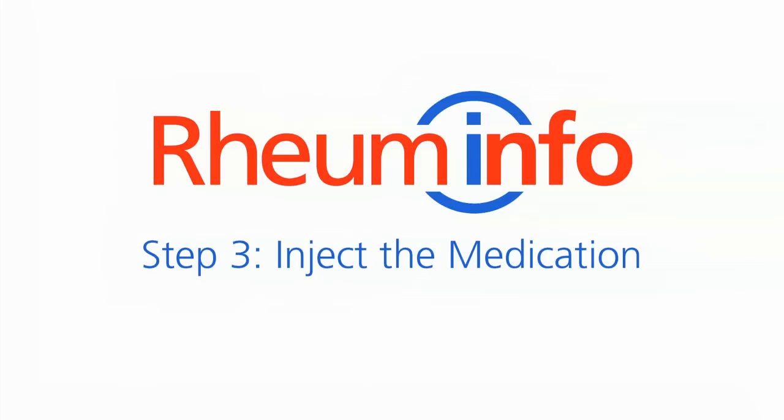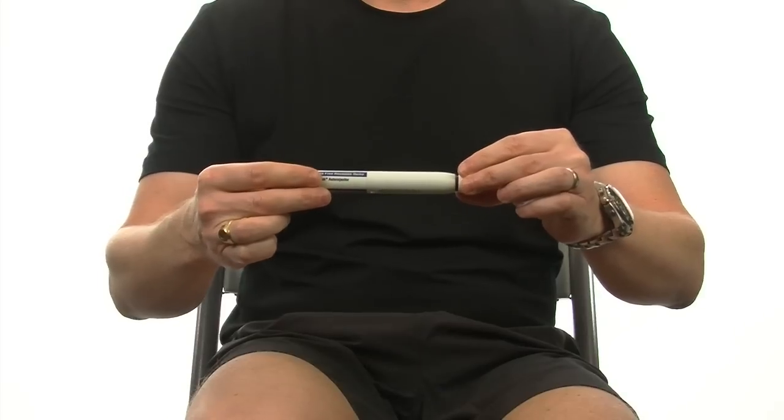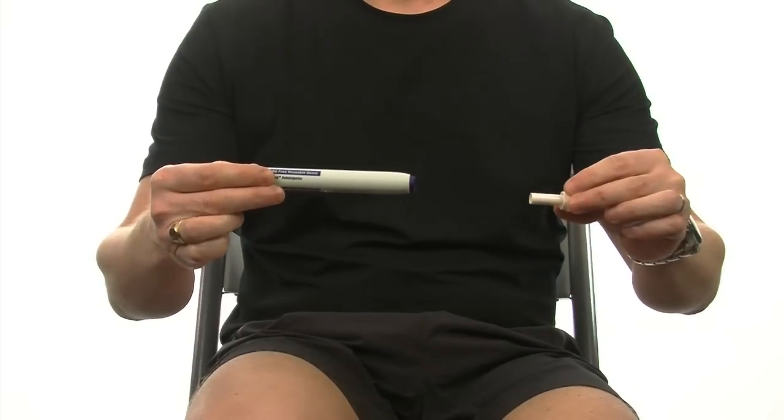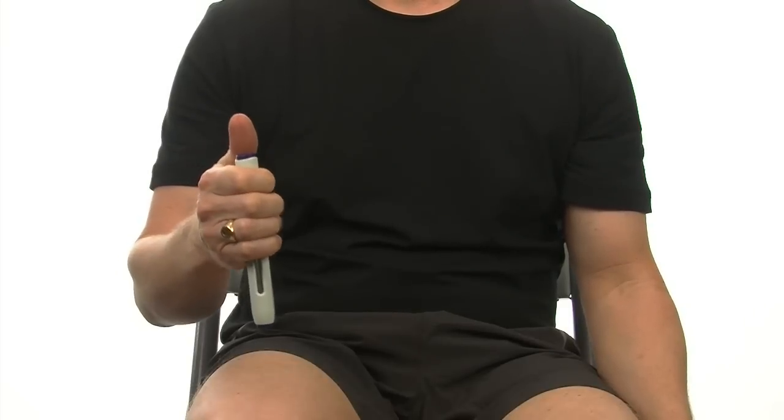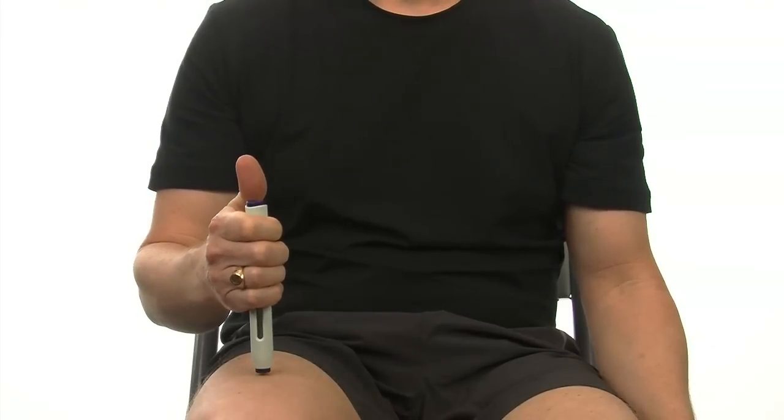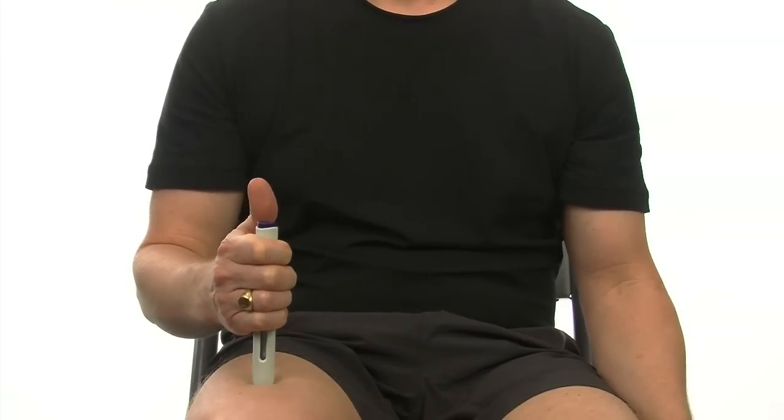Step three, inject the medicine. Remove the needle cap from the auto-injector. Place the auto-injector on the injection site at a 90 degree angle. Push the auto-injector firmly against the skin to unlock the device.